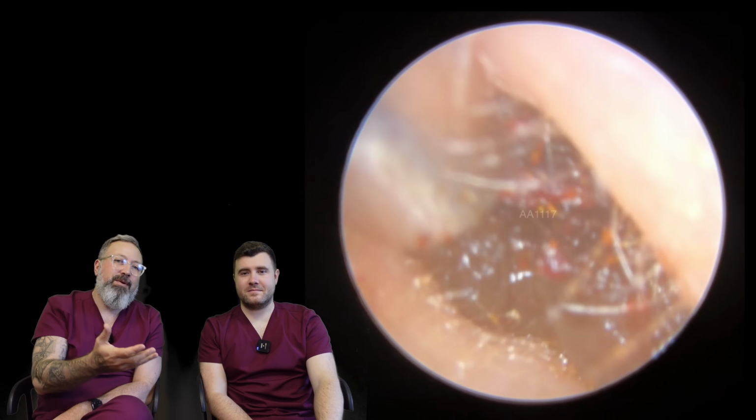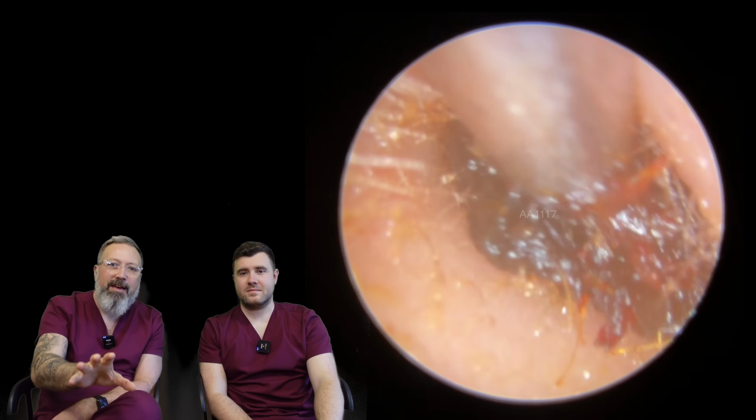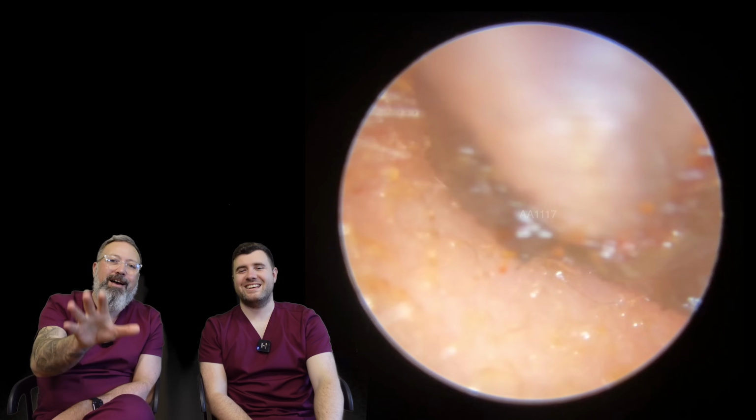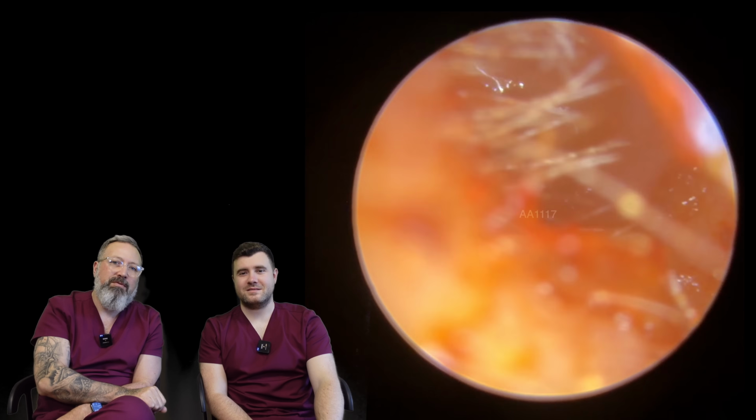And this is why I always say to the patient, as the wax is coming out, the hearing might come and go a little bit. That's perfectly normal. Don't panic. You've not gone deaf. It's just wax blocking the canal up. And this is what I was explaining to this patient as we were going through.